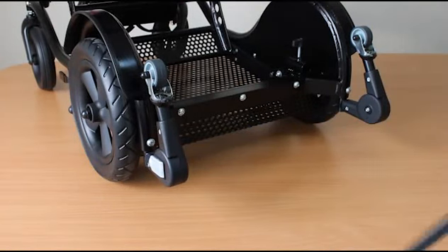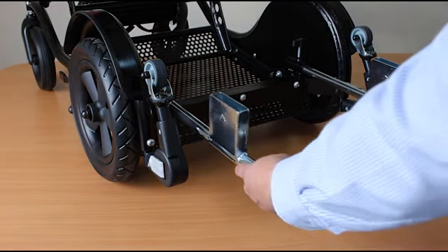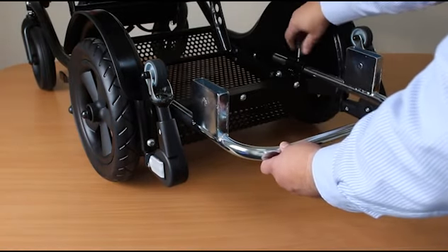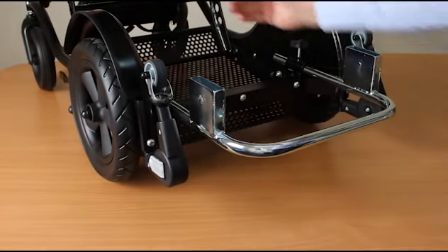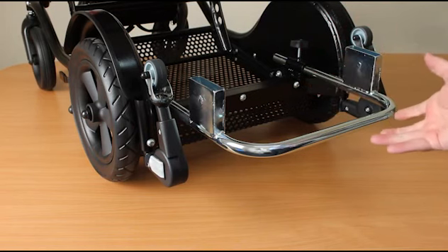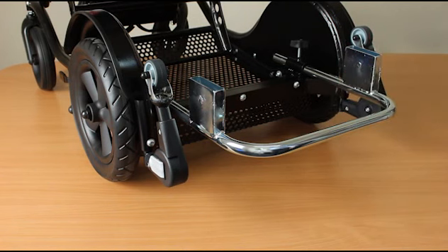Now let's look at how the rear seat attaches. The main part needed for all of the seats is this interface connector, which slides into these two receivers and should be secured using the hand wheels on either side. There's a fair amount of adjustment backwards and forwards — we would always suggest moving the seat as far forward as comfortably possible towards the front seat, to improve the load stability and weight positioning.